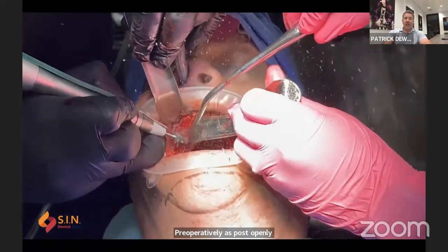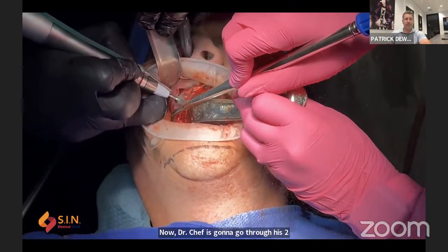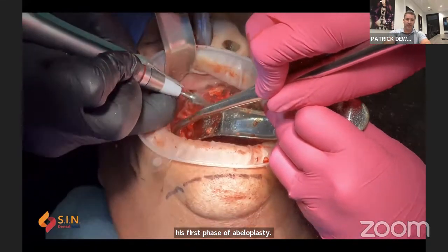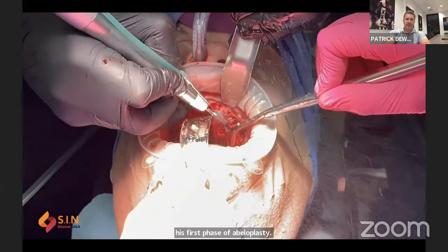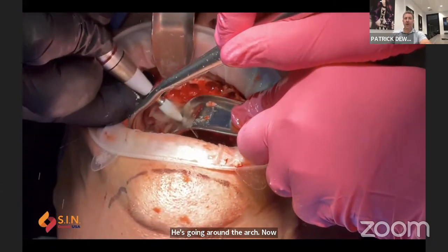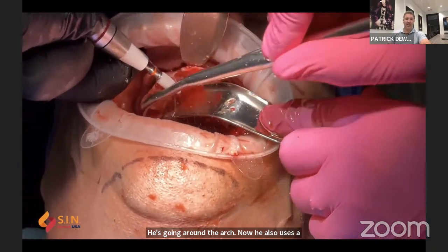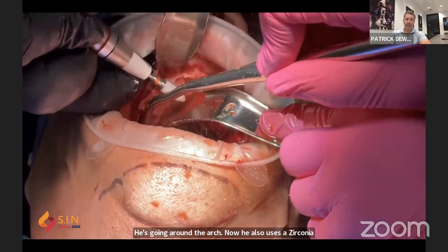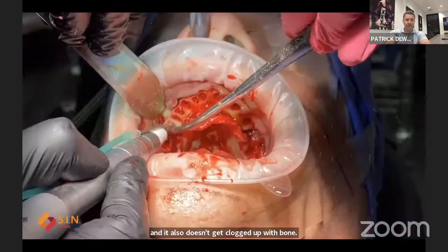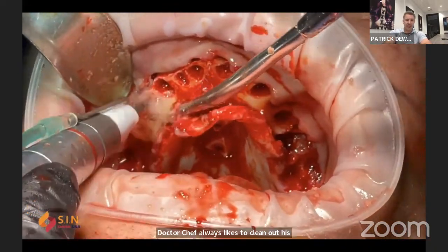Now, Dr. Sheth is going to go through his 2-stage bone reduction. He uses one of those standard acrylic burrs for his first phase of alveoloplasty, as you'll see here. He's going around the arch. Now he also uses a zirconia burr for his final finishing of his bone reduction, because it doesn't dissipate a lot of heat, and it also doesn't get clogged up with bone. It's a very nice burr. Dr. Sheth always likes to clean out his extraction sites.